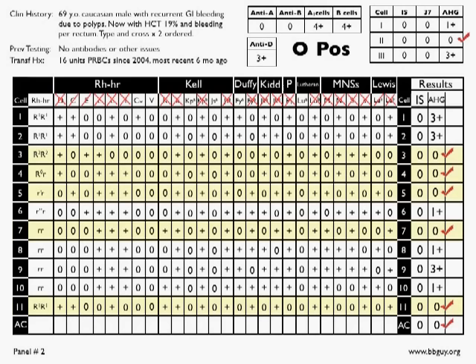The next step, just as before, is we circle the antigens that have not been ruled out as the target of our antibody. Again, the good news is that most of these you can kind of get rid of in your brain because they're ones that aren't really represented on the panel. Wow, for this one, we're really down to Duffy A and Duffy A alone. Everything else has been ruled out at least once, or is something that we're kind of ignoring.